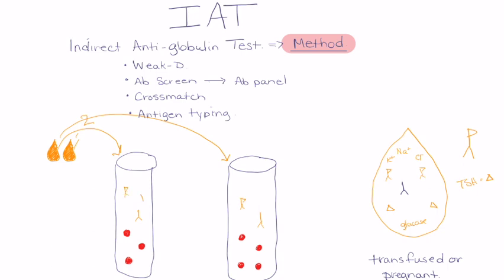Maybe you had the flu vaccine, so some flu vaccine antibodies. We know they don't last forever. That's all right. Okay, so if there's a red cell antibody, we'll just show it's attaching to this one. Okay, because there's something on the outside of screening cell 1 that it matches to.